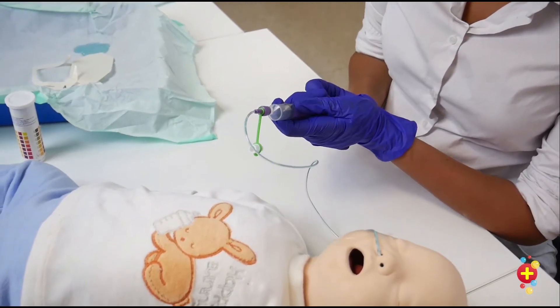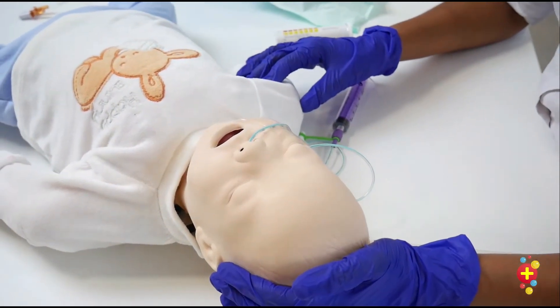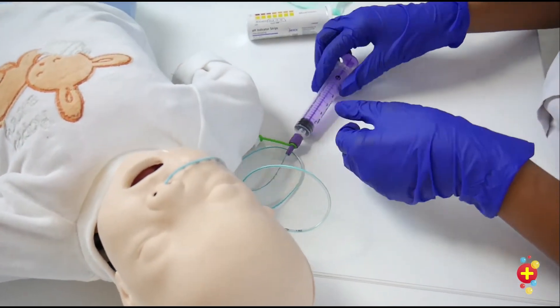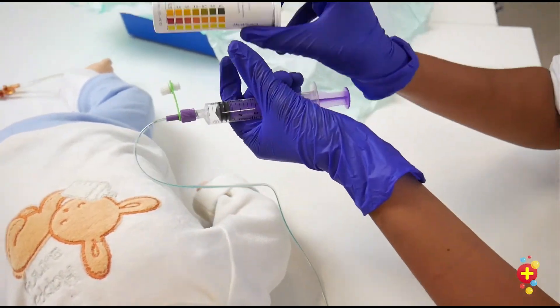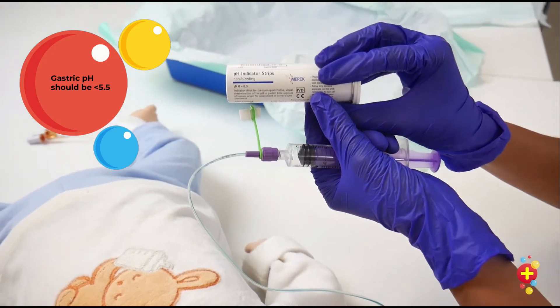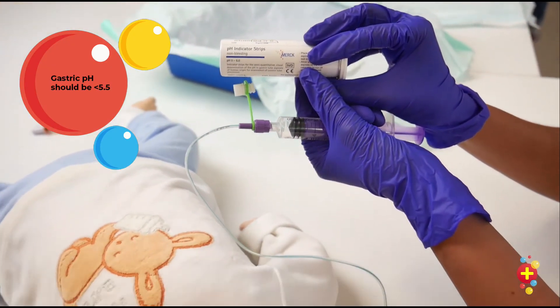Draw back, looking for gastric content. You would usually have a second person to assist with holding the head, and you would check the gastric pH using a pH indicator strip, aiming for a pH of less than 5.5.